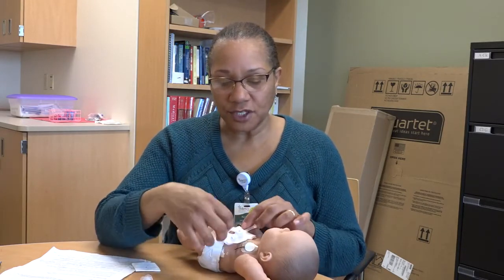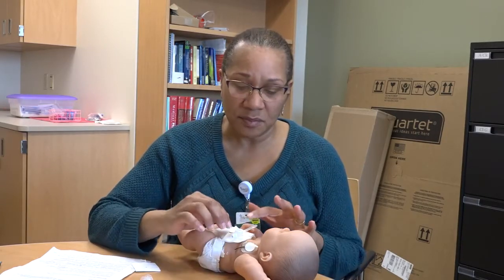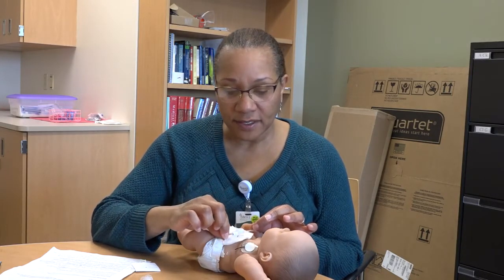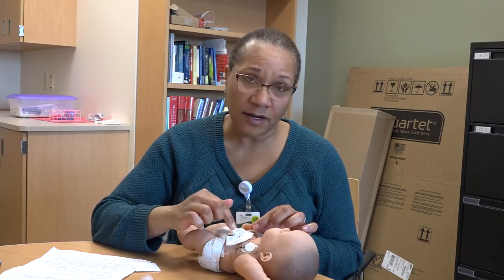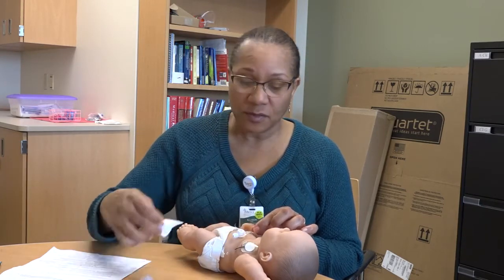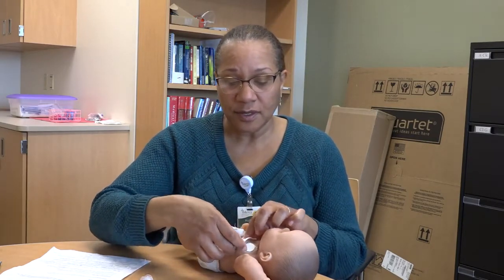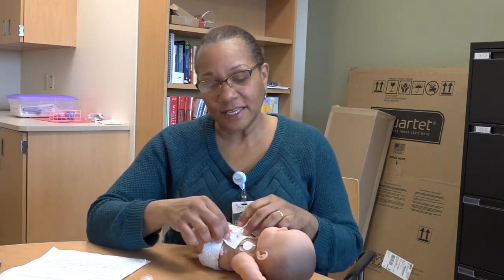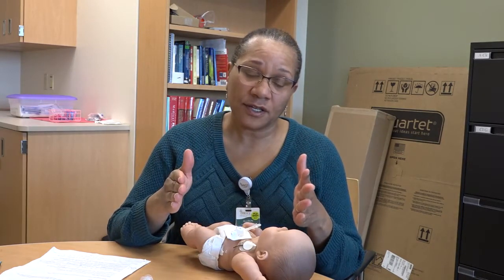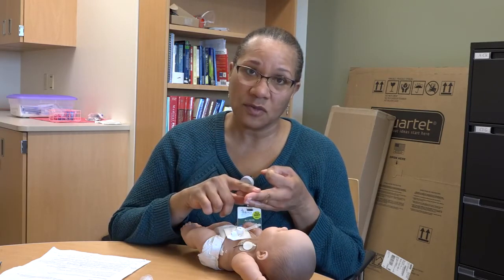The reason why we continue to use that split 2x2 is so that we can keep the wound clean and dry. We don't want there to be any buildup of drainage, wetness, soiling, anything on here. If you notice that, then please take this off and replace it with another 2x2. There isn't necessarily a scheduled time for changing these 2x2s. We just want to keep that area clean and dry. So if it's wet, if it's soiled, then it needs to be replaced.